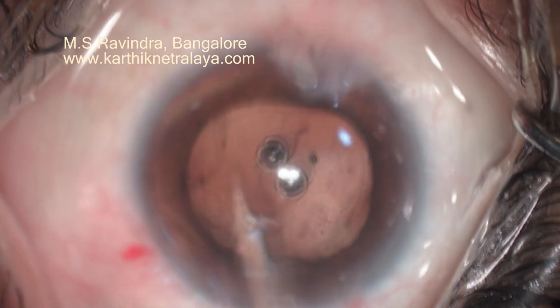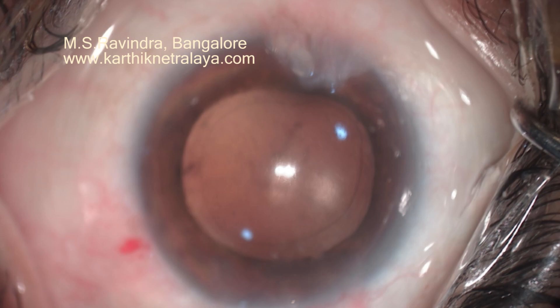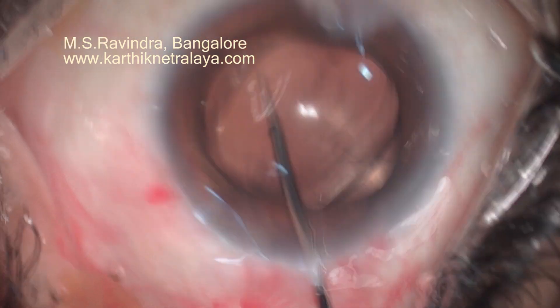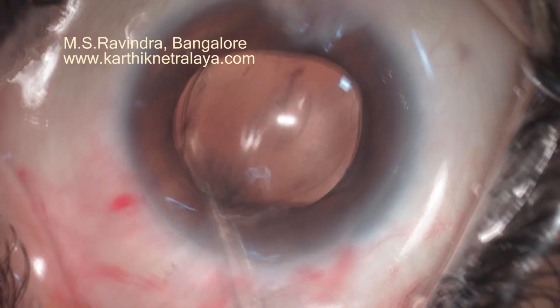You can see the silicon oil shimmering through the posterior capsule. Certain deposits are present on the back of the capsule which cannot be removed. The IOL is placed in the bag.